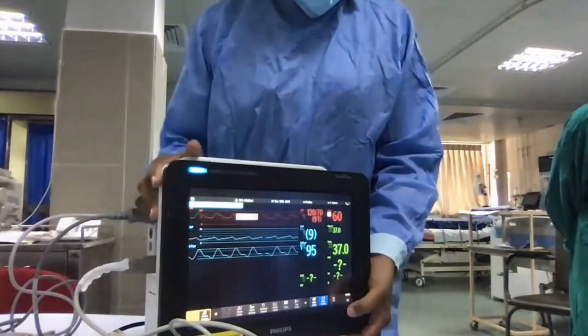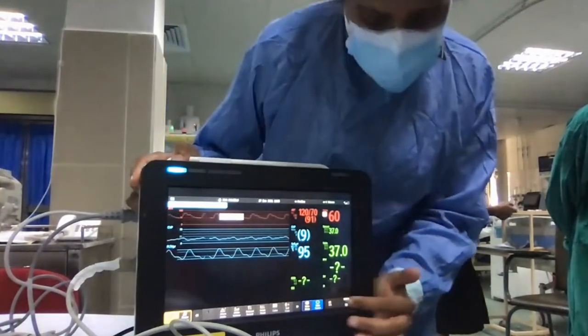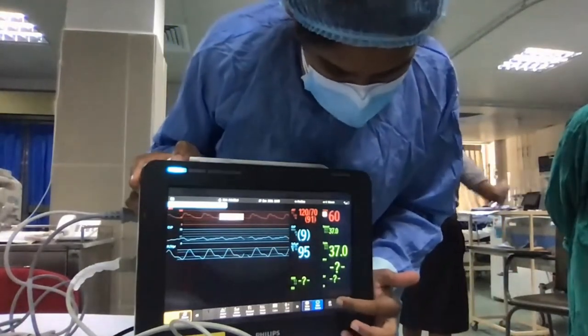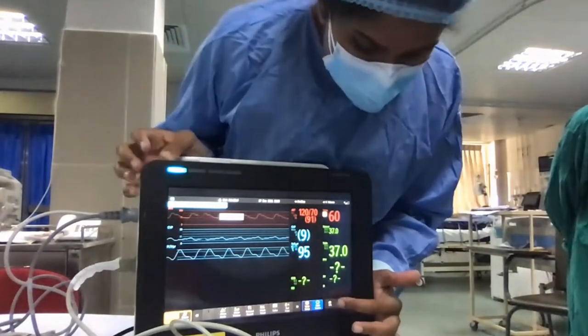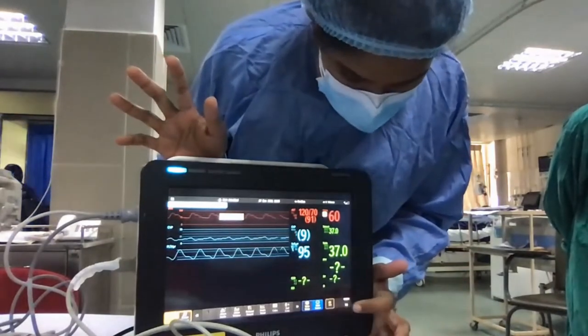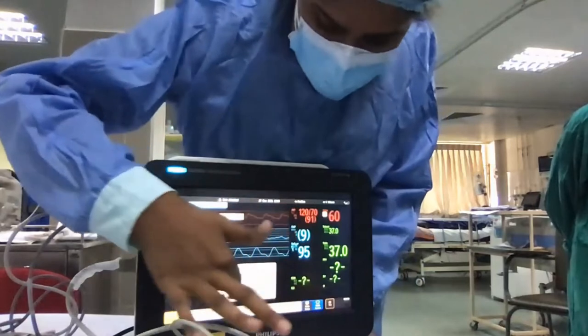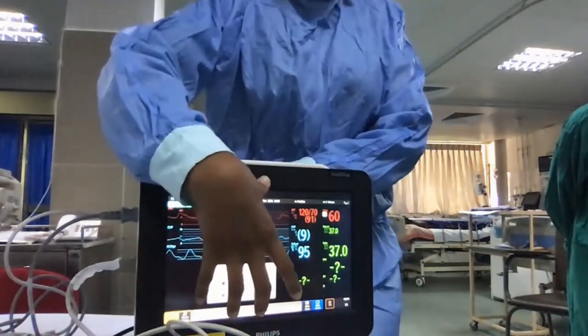there is a small icon. Can everyone see the screen now clearly? I don't think they can see the small one, but anyways, to your leftmost corner, there is an icon which indicates 3X signs. Click on that. That is actually what we call the measurement selection. Click on it. Then you can see the setup like this. Whichever you have connected here, madam, you can get a display of that.